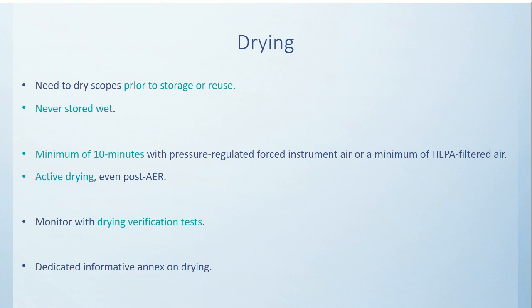So drying post-processing receives considerable attention in this new version of ST91. Scopes must be completely dry before they go into storage or they're used again clinically. So the bottom line here is before they leave the processing area, their scopes are dried, in addition to whatever happened in an automated process.